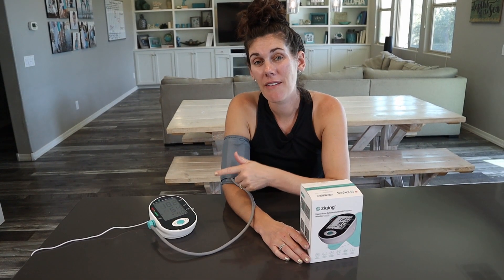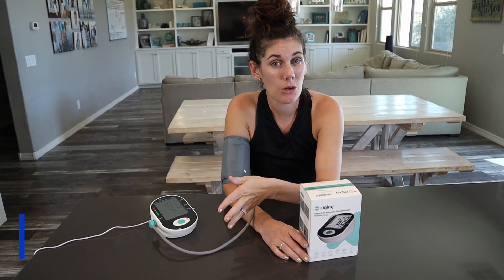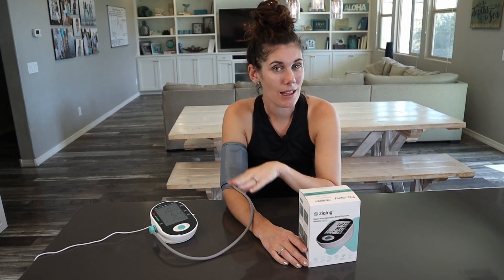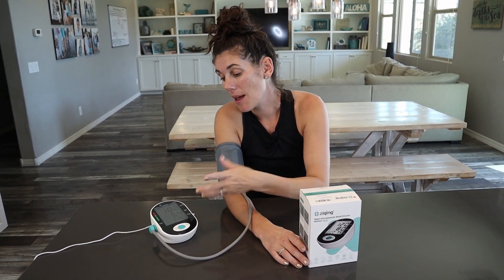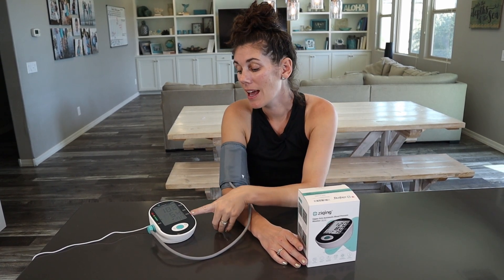What's nice is that the voice broadcast tells you at the end if your results are normal, if they're elevated, or if they're low — and that just gives a little peace of mind. This also has a great LCD screen, nice and large and easy to read.